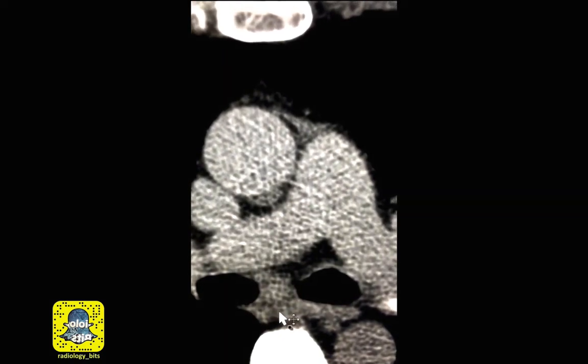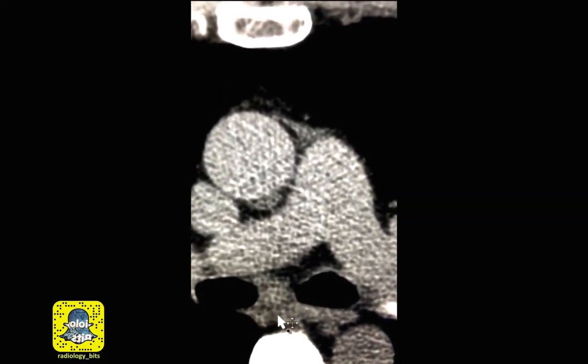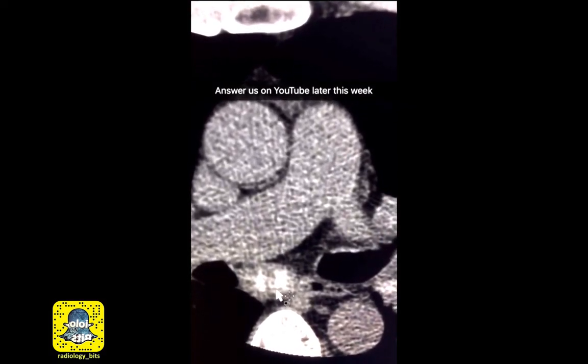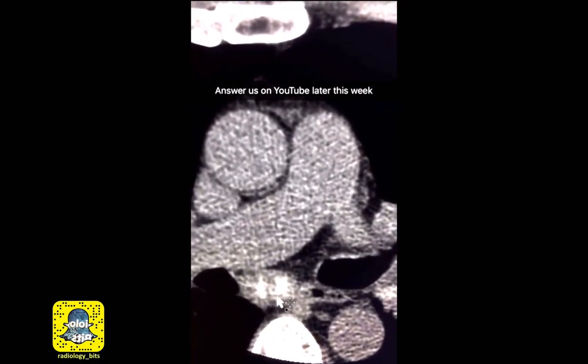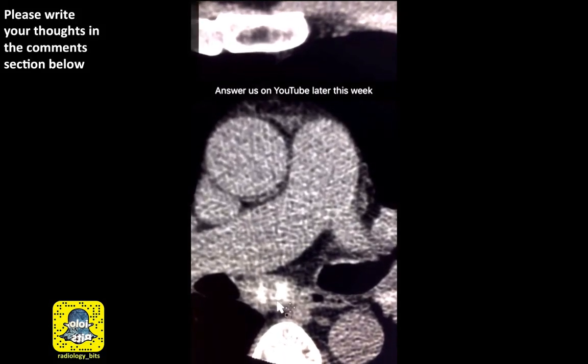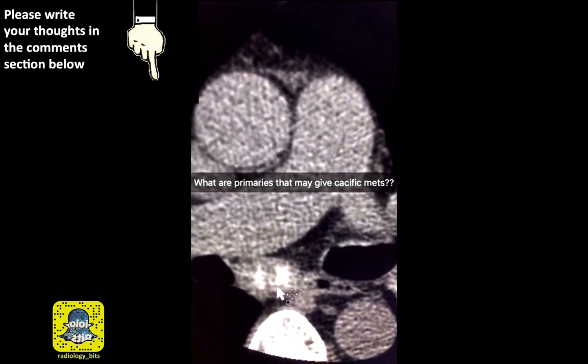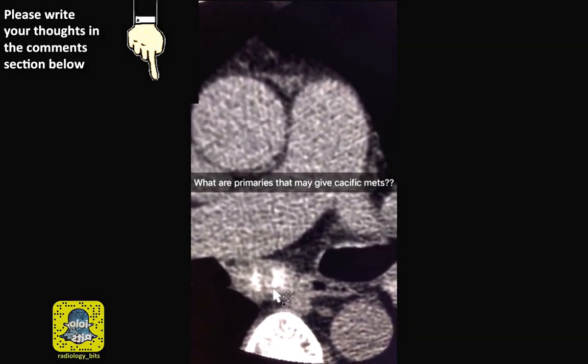Now, before we end this case, I will ask you a question, and you could post your answer at the end of the week when we put this clip on the Radiology Bits YouTube channel in the comment section. The question is, what are the primary neoplastic processes that could give you calcific metastasis to lymph nodes?